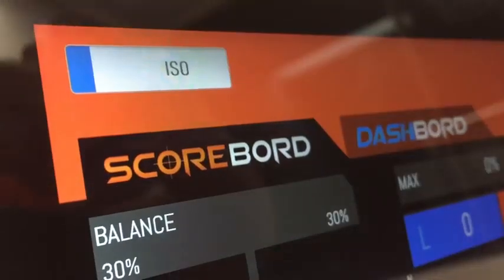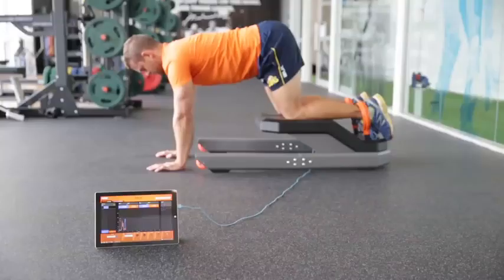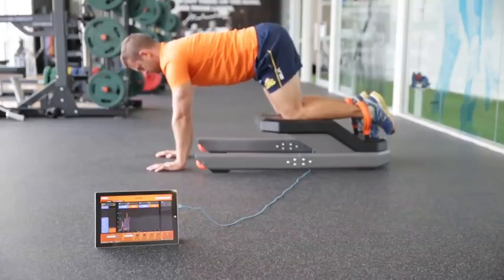The Nordboard can also measure isometric hamstring strength with the athlete in a variety of different positions, making it ideal for low impact and sport-specific strength testing.